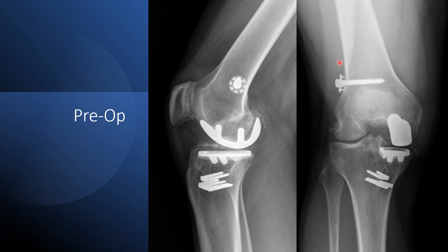So we're going to work on converting this, and we have three main problems. We have hardware, a femoral screw, and two tibial staples. We also have hardware here in the partial knee replacement. We're going to have a bone defect, and then we're going to need to figure out how to restore mechanical stability, both in the femur and the tibia. And we'll walk through those processes.